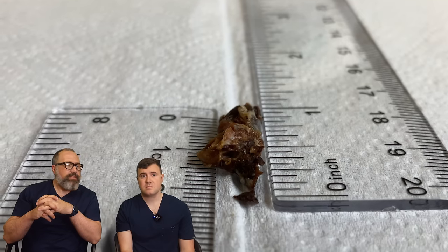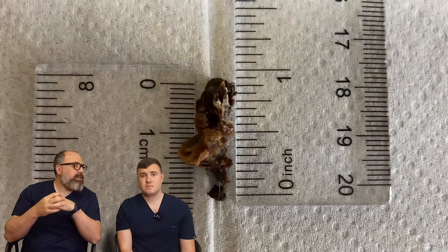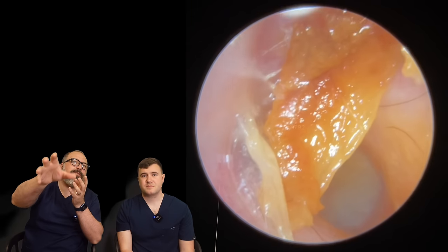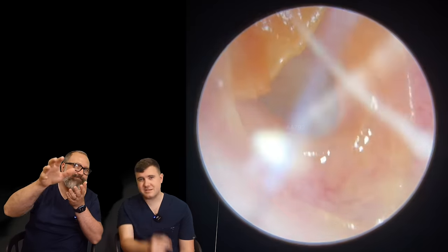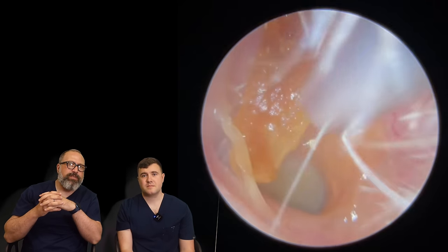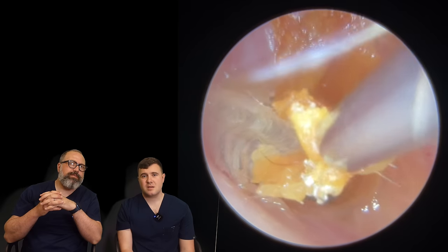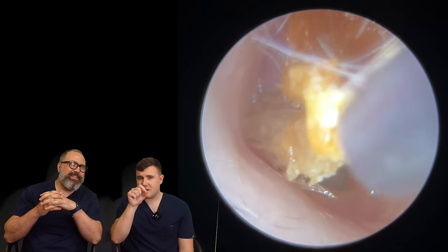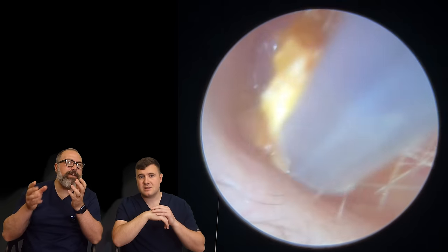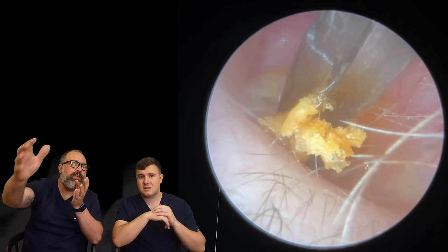I think there's one more — I think this last one's mine. I think the last one's an eardrum peel. We can see this layer at the top that looks a bit like wax and skin — that cream layer you can see all around the outside edge. This was a bit of an unusual one because I thought we were just dealing with this plug here. We've opted to go with the fine end straight away. You can almost see the edge of the skin where it's all peeling away. I didn't expect to see it — we went straight in to get the fine end on that just to stop the clarinetting, and then we suddenly see this whole section peeling from beyond it. So we've got the crocodile forceps. Look at that peel — coming away beautifully. It's actually peeling down the canal, the attic portion, the roof of the canal. There was a heck of a lot of skin in here that I didn't expect.